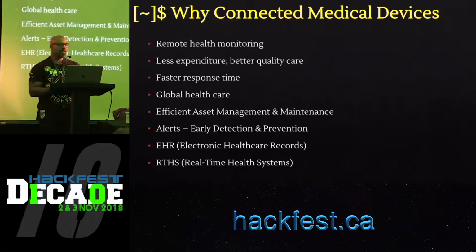One of the challenges for the medical institutions going forward would be that there will be tons of medical devices, and they need to make sure that they have enough bandwidth to support all these medical devices. They would also need to make sure that there's enough segregation. Because there are going to be so many medical devices, how do you segregate the network?